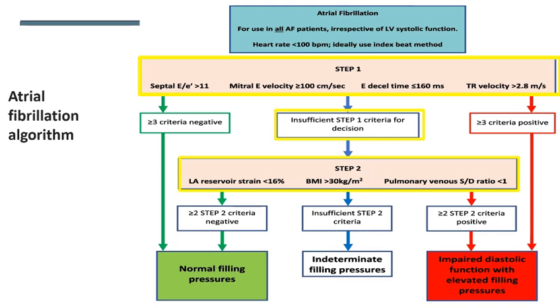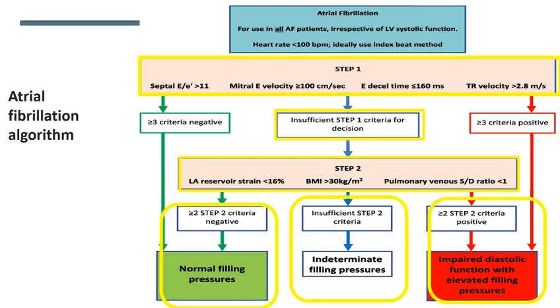LARS, PVS/PVD ratio, and BMI. When 2 or more of these are positive, filling pressures are considered elevated. When 2 or more are negative, filling pressures are considered normal. If these criteria in step 2 are not met, left ventricular filling pressure is indeterminate.